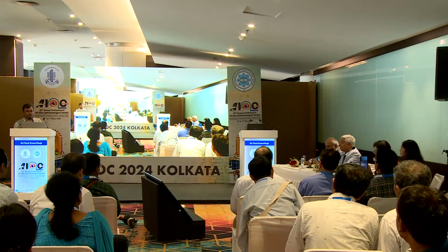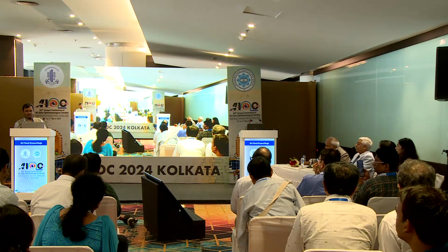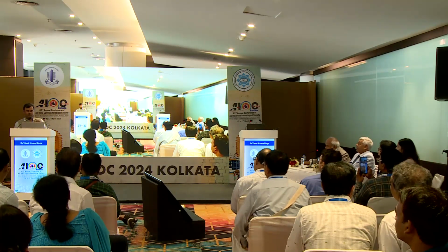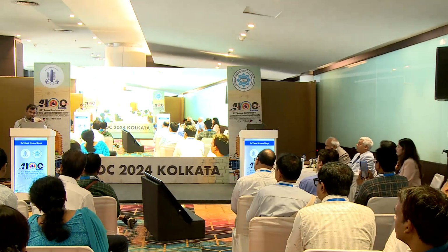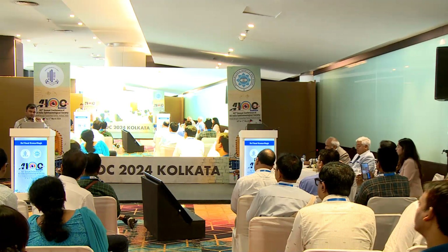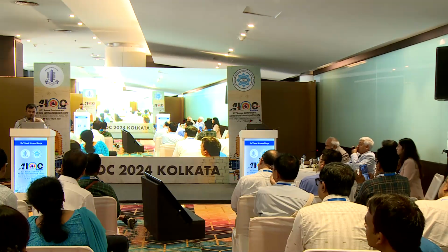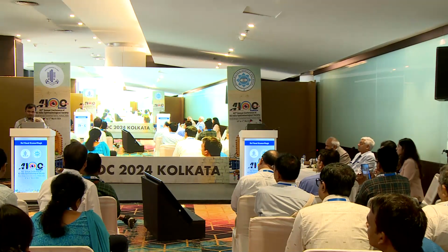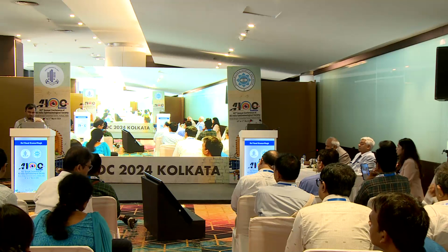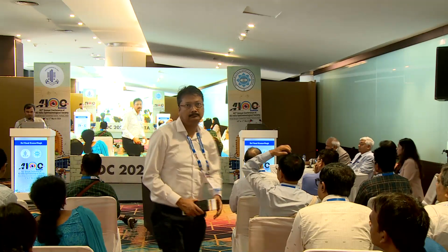Thank you so much. One more point I would like to add. While enclavating the second side of the IOL, while you are holding your IOL with the forceps, you should pull the lens a little bit anteriorly towards your port, because while you are holding the lens, your superior iris is dipped downward, so you are not sure whether it is covering the whole pupil or not. So you can put a little pull towards yourself, then enclavate it. Then the whole pupil will be covered with the IOL.